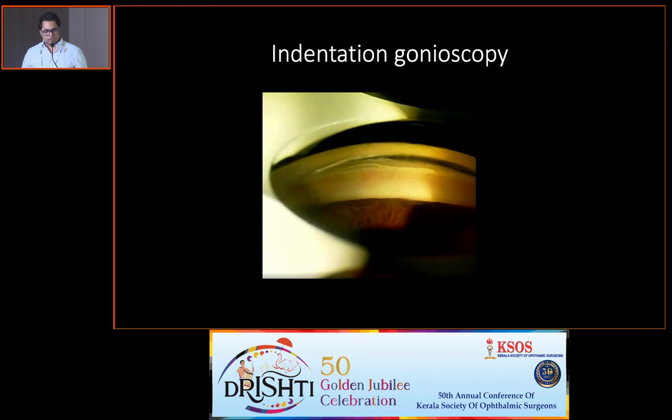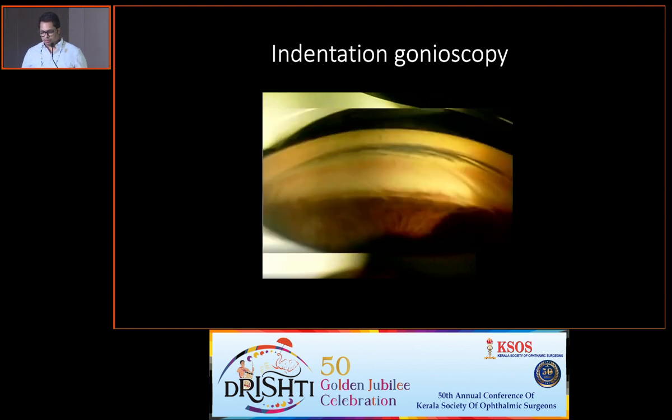This is a clinical picture of indentation gonioscopy. You can see there is no angle structure visible. After indentation, the angles are open.